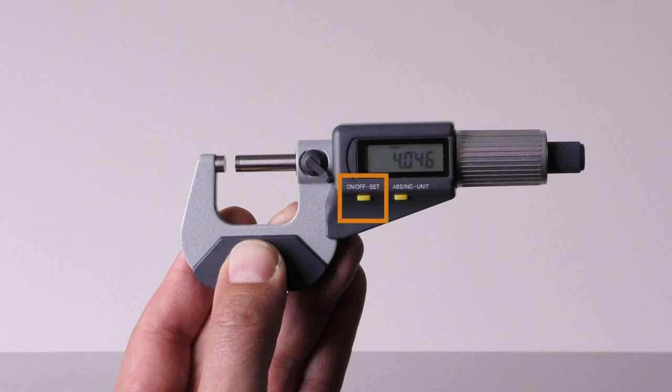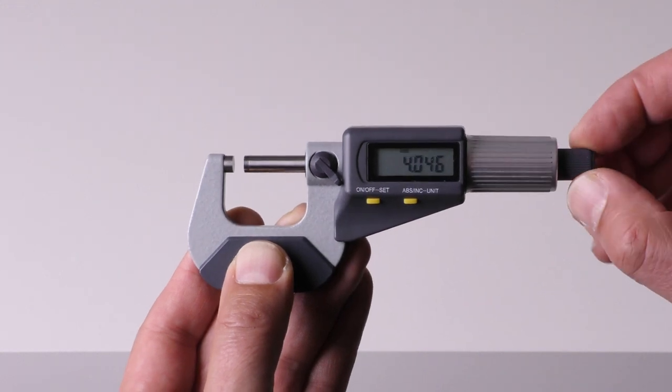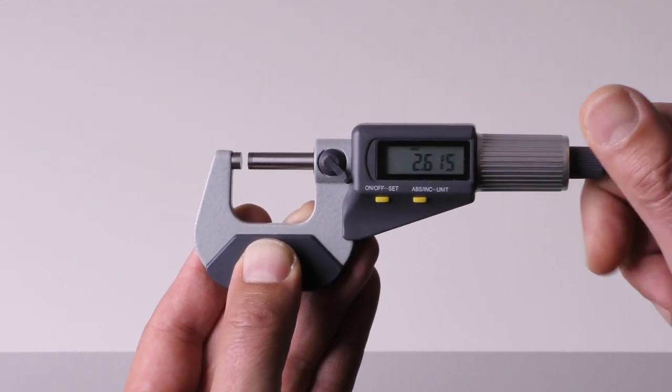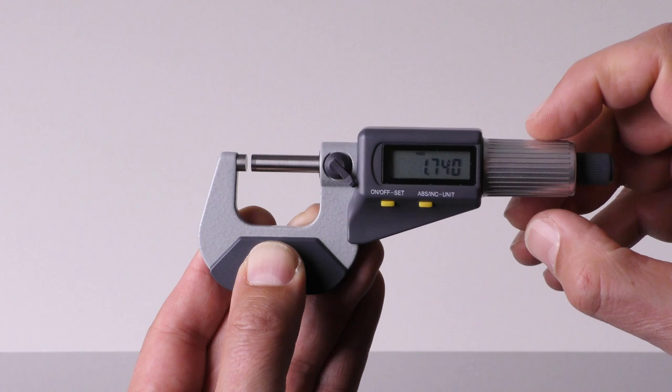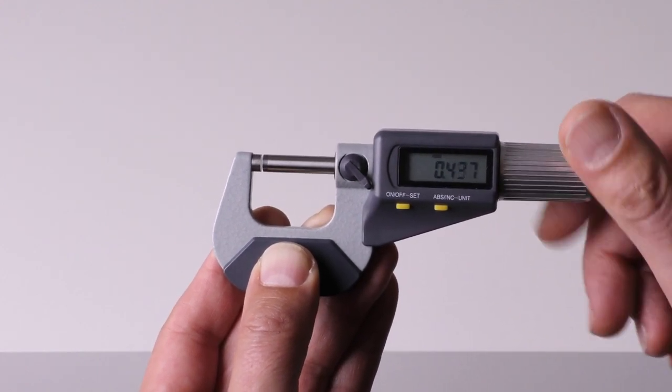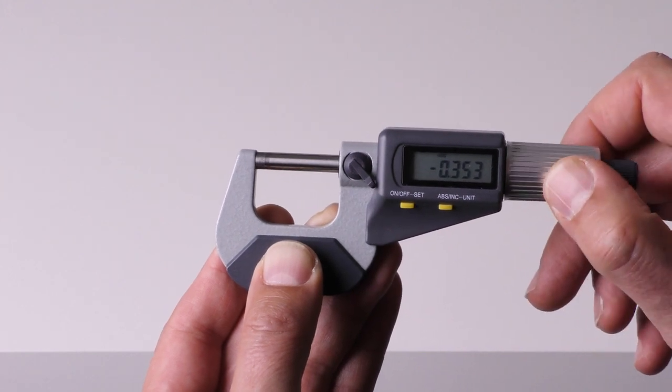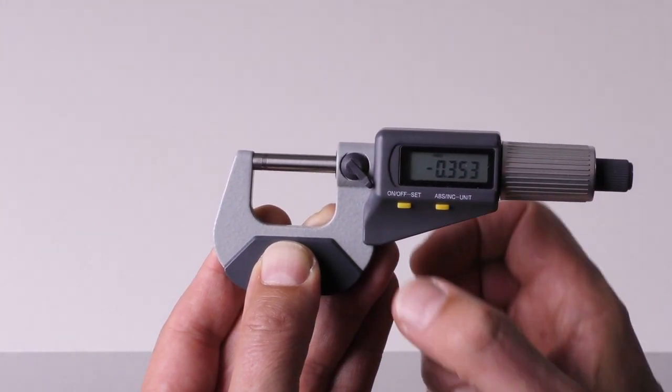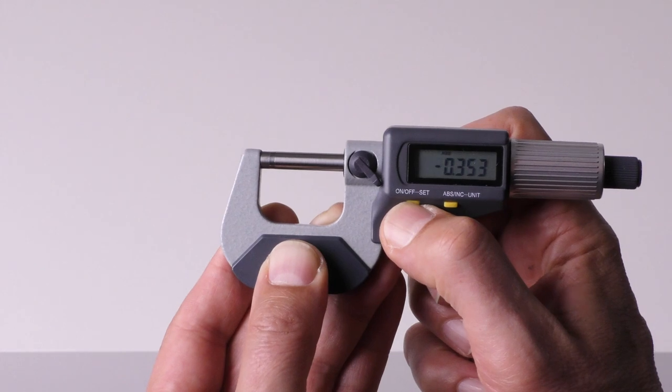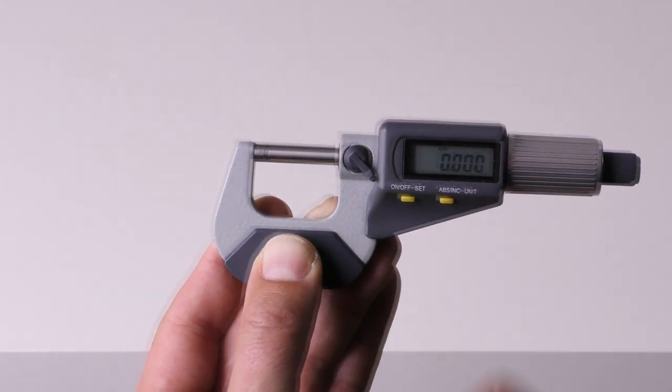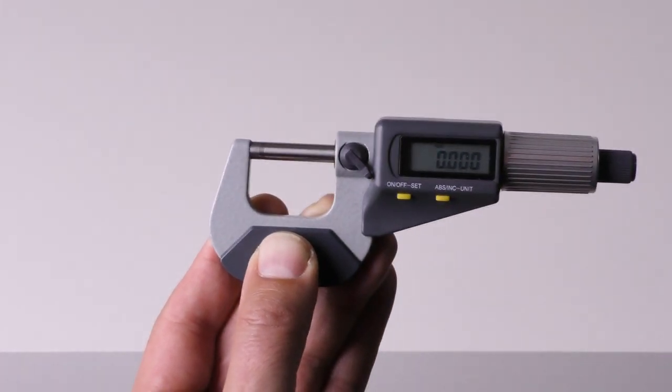Switch on the micrometer by pressing the on-offset button. Adjust the measuring surfaces to a distance of approximately two millimeters with the quick drive. Then slowly turn the ratchet until the measuring surfaces touch each other and the torque mechanism was triggered. Now press and hold the on-offset button for three seconds. The value 0.000 on the display indicates that the zero point is set. The micrometer is now ready for measuring.